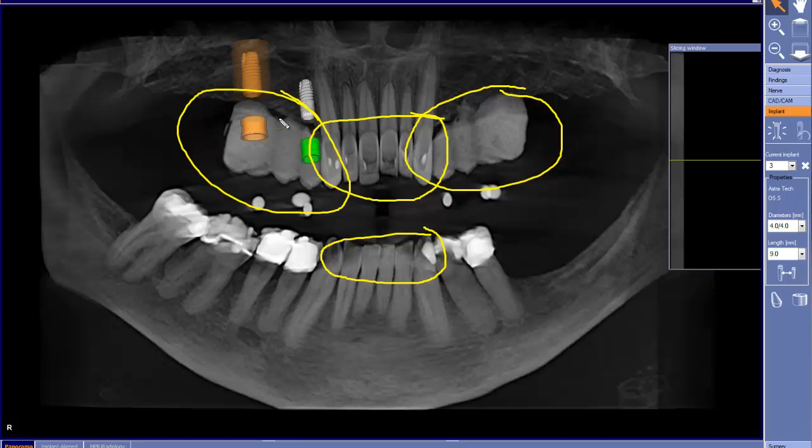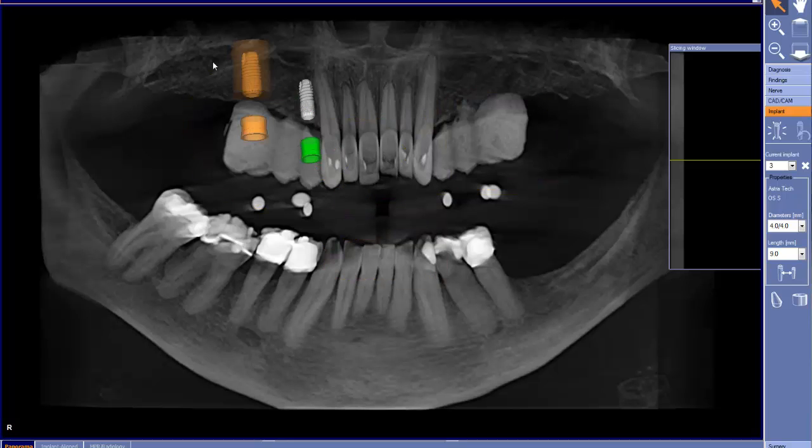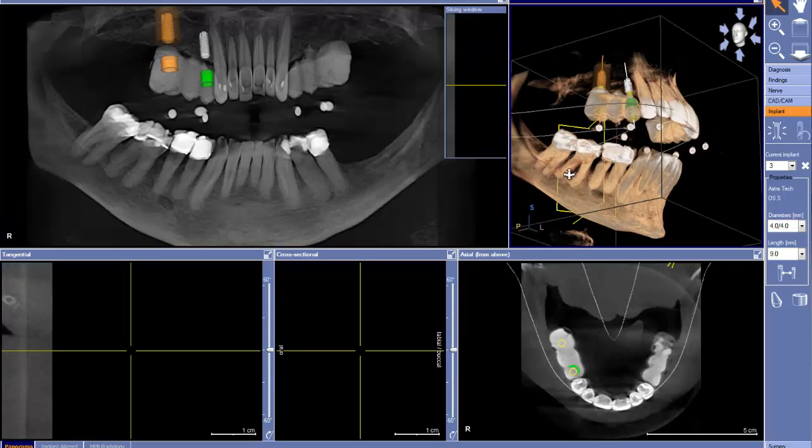So when we have distal extensions, certainly two distal extensions like this, it makes all the sense in the world to go ahead and have this scanned as it is. So great job on choosing the right surgical guide. I hope it wasn't by accident, but by good planning and knowledge. So now let's go ahead and focus on the case.